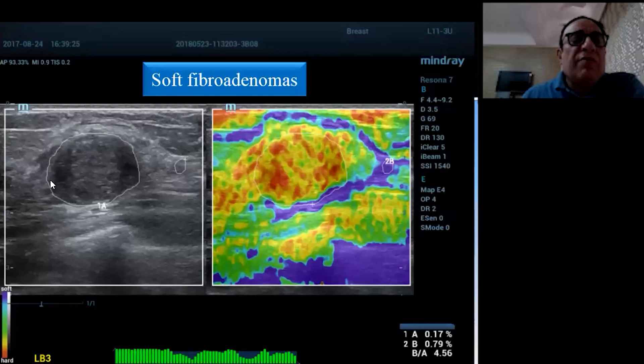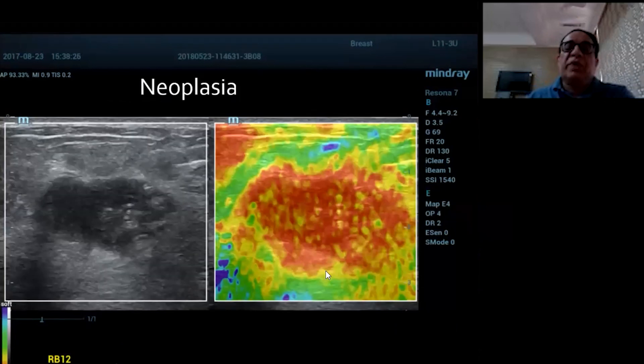Here you have a fibroadenoma which has a mixed color score of two, as you can see there are hard and soft areas. When you highlight the lesion here it corresponds to the lesion here, and therefore it could be a soft fibroadenoma.